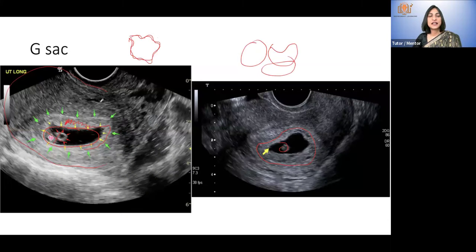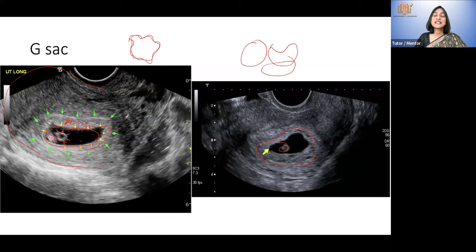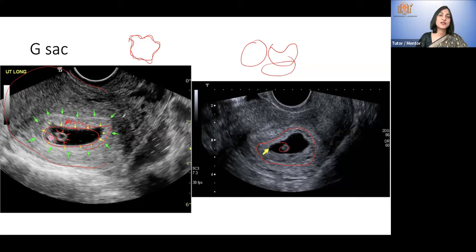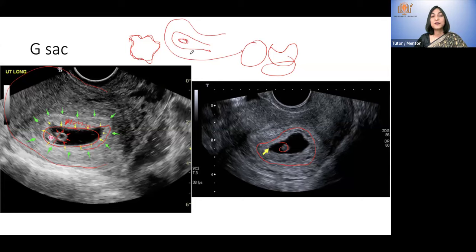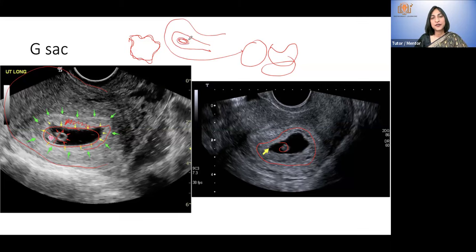Pseudo-gestational sac is seen in ectopic pregnancies, where the gestational sac is in the fallopian tube or elsewhere. In the uterus there is an intense decidual reaction — an arias-stella reaction — because of HCG produced by the gestational sac and progesterone from the corpus luteum causing decidualization. In a pseudo-gestational sac there is no embryo. There is intense arias-stella reaction with decidualization and a small amount of fluid collection which looks like a gestational sac, but it does not have the intense choriodecidual reaction around it.